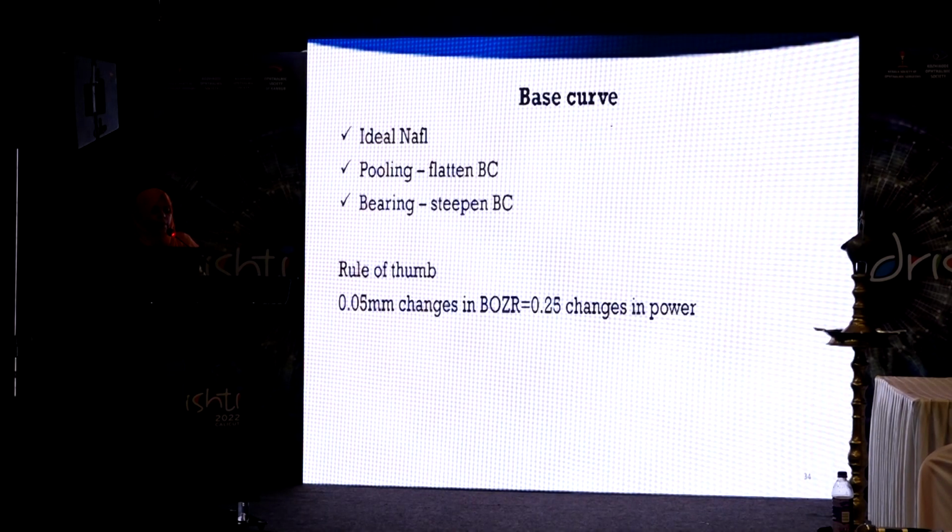So for the base curve, there should be an ideal sodium fluorescein pattern, and if it is pooling, it means a steep fit, so you have to flatten the base curve. If it is bearing, it means there will be a central touch, and you have to steepen the base curve. Here also we follow the rule of thumb, where a 0.05 change in back optic zone radius is equal to a 0.25 change in the power.